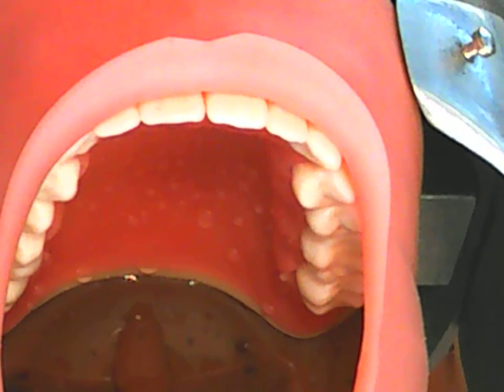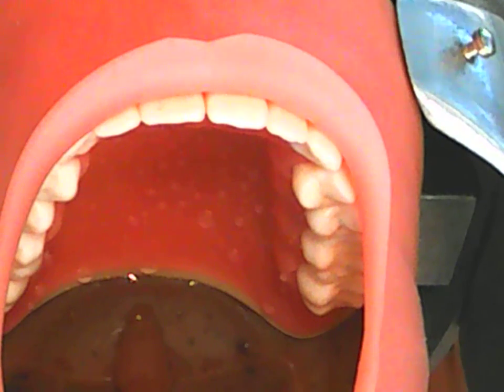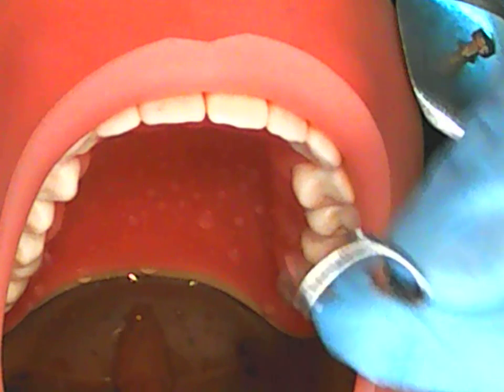Okay, so once I've selected my clamp, I'm going to attach a piece of safety floss onto the bow of the clamp to ensure client safety. In case it pops off during application, you will have a piece of floss to hold on to, to prevent aspiration of the clamp. Okay, here's the clamp.